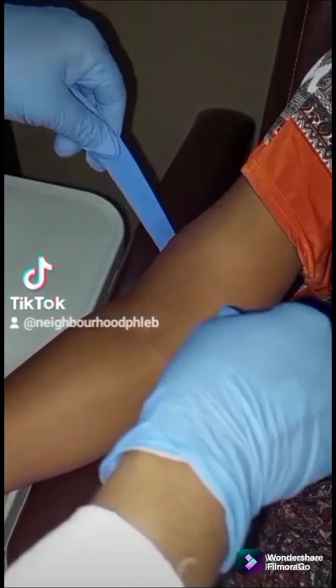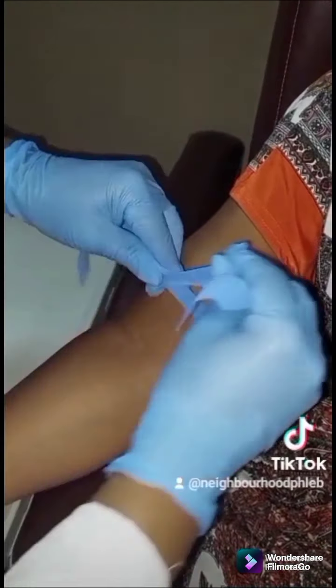Some equipment and supplies routinely used by phlebotomists are phlebotomy chairs, trays, carts, 70% isopropyl alcohol swabs, gauze, tourniquet, and needles, which include hypodermic needles, multi-sample needles, and wing infusion sets, better known as butterfly needles. We'll touch more on those later on. We have our face mask and gloves. We also have our evacuated system tubes. We have our biohazard bags, biohazard containers, and sharps containers. We have our disposable gowns, lab coats, lancets, watch, pens, and so on.